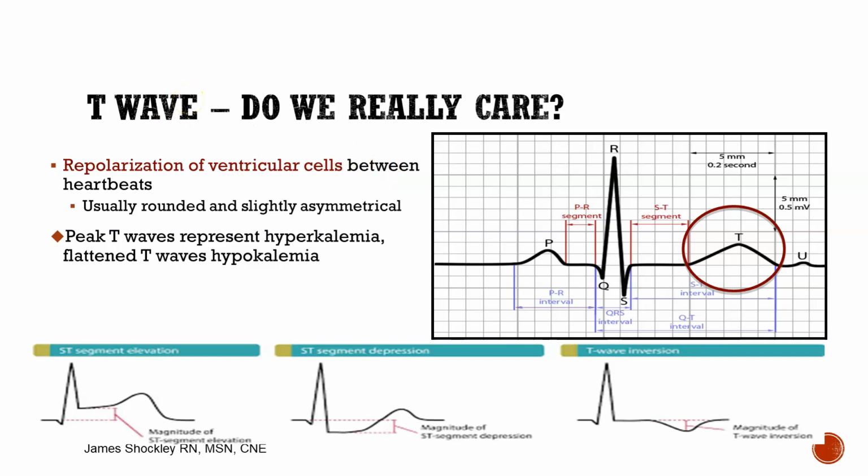T-wave. Do we really care? Absolutely not. It does not affect my interpretation. Again, look at the MAR, look at the electrolytes. You're probably not going to find anything different. We talk about the T-wave because of the ST segment, and that's just the honest truth.